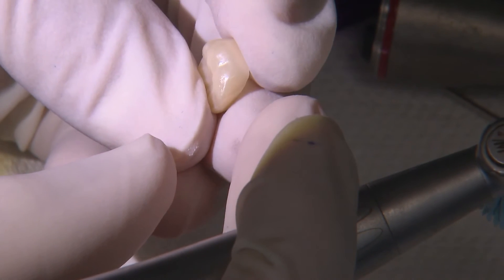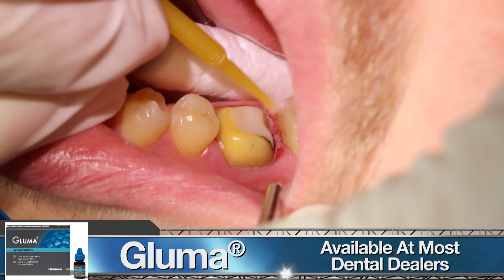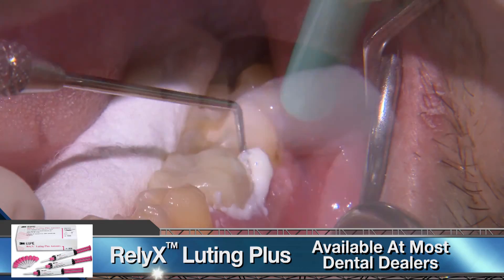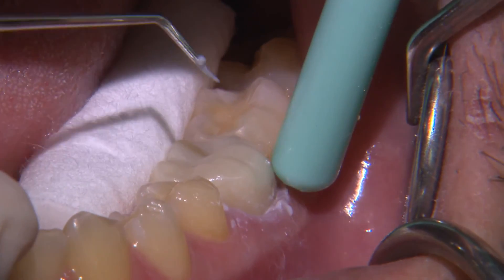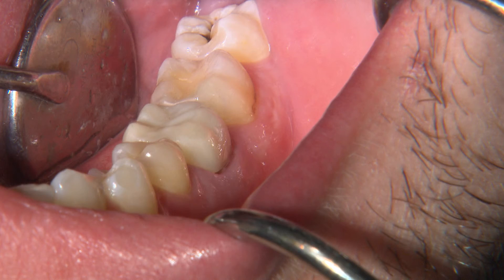Since the tooth is endodontically treated, I only administer local infiltration for gingival pain control. I begin the removal of the old crown with a 557 carbide to section through the buccal and occlusal. I use light pressure to ensure I don't mutilate the underlying tooth structure, since most gold crowns are fabricated very thin. Once I can visualize the prep, I use a 90-degree Christensen crown remover to break the seal between the crown and tooth, and wiggle the crown off using crown removal forceps.